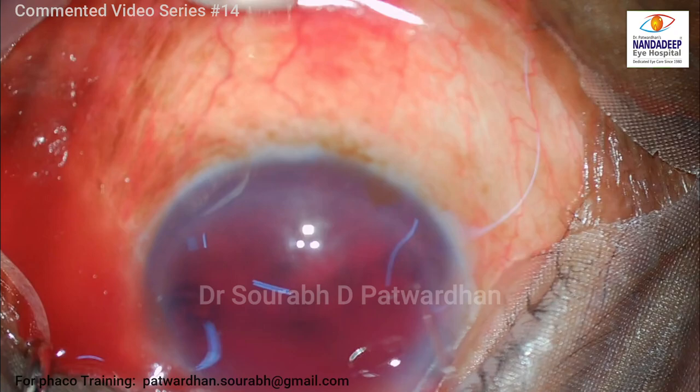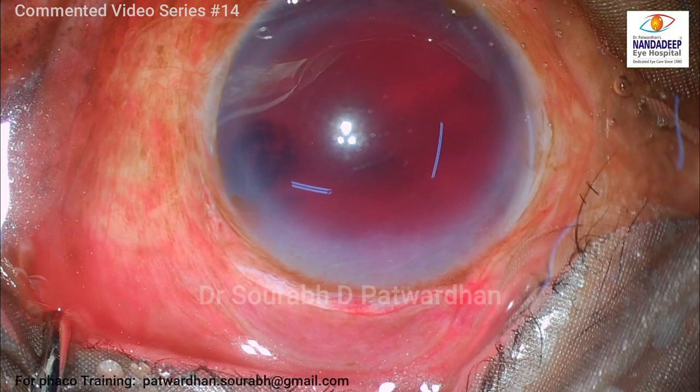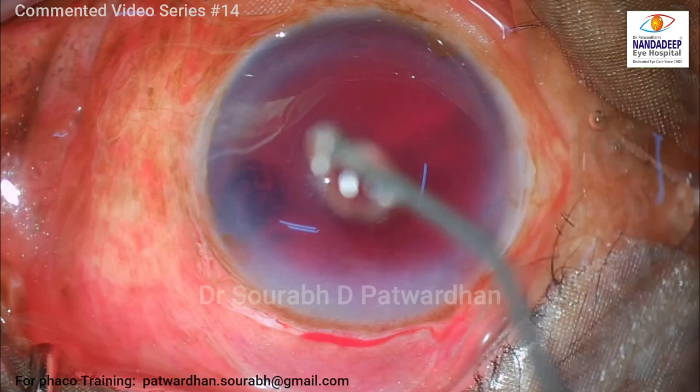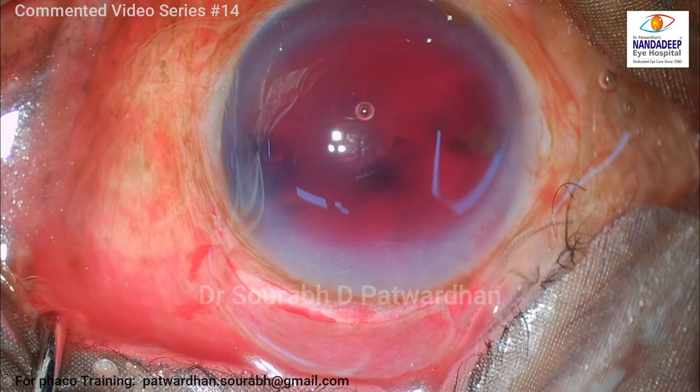Because if you keep this kind of hyphema in the chamber for a long time, there is a high risk of corneal endothelial staining, and that's going to give a very bad prognosis or very bad vision in the long term. So I have decided to remove this hyphema. We'll speak about what the principles are behind doing hyphema removal, or hyphemectomy.